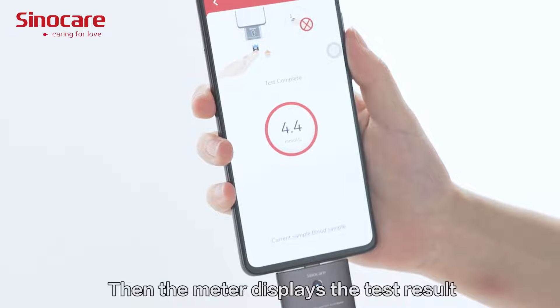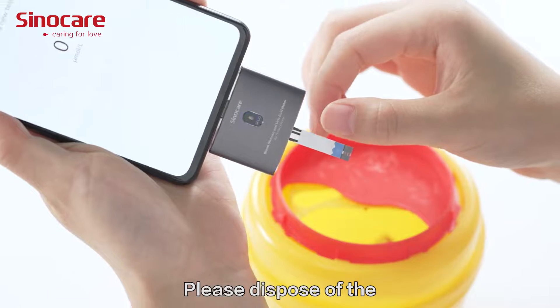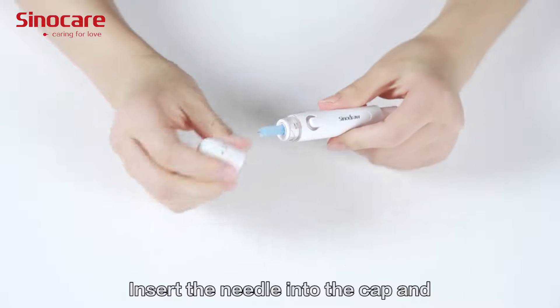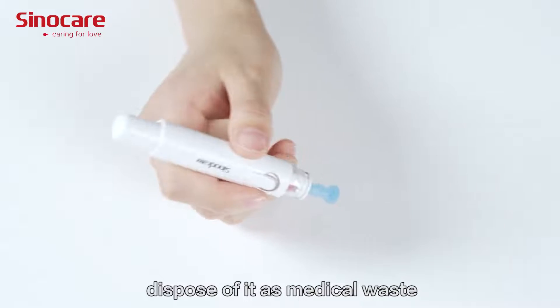Remove the test strip from the drop immediately once the meter begins the countdown from 5 to 1. The meter then displays the test results. Please dispose of the test strip and the needle — inserted back into the cap — as medical waste.